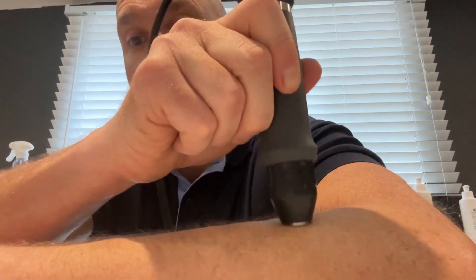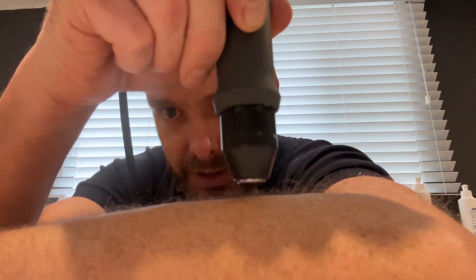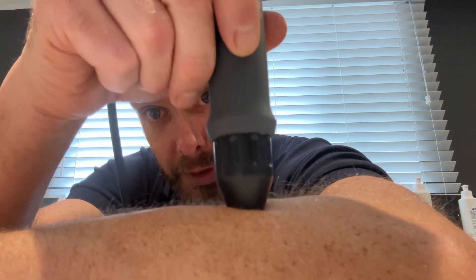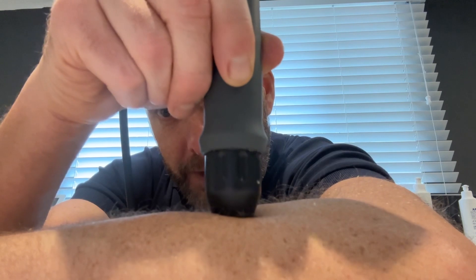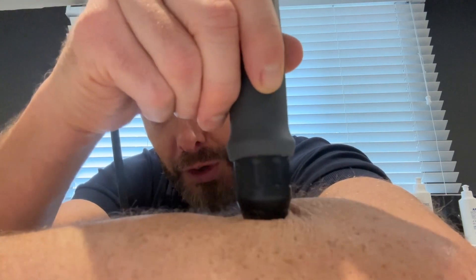The next thing is pressure. If we're working on tissue with no pressure at all, we're losing energy all the time. Apply a little bit of indent pressure — not pushing through to next week — just enough so the whole of that little disc disappears and is surrounded by the skin tissue. Then you know you've got contact with the muscle, tendon, or ligament, whatever it is you're trying to work on.